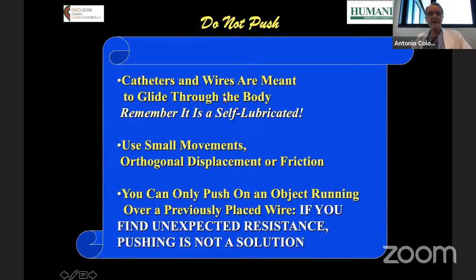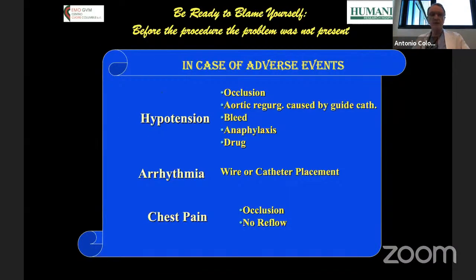Catheters and wires are meant to glide through the body. Remember, it is a self-lubricated environment. Use small movements, orthogonal displacement or friction. You can only push on an object running over a previously placed wire. If you find unexpected resistance, pushing is not the solution.